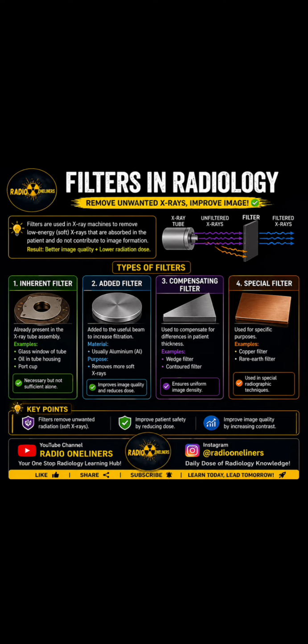Now let's come to the third filter, which is the compensating filter. As I've already written over the image, compensating filter. As the name suggests, what is it going to do? It is going to compensate something.